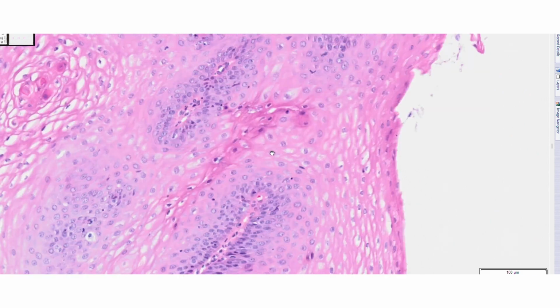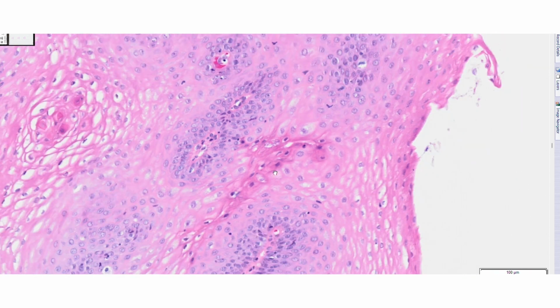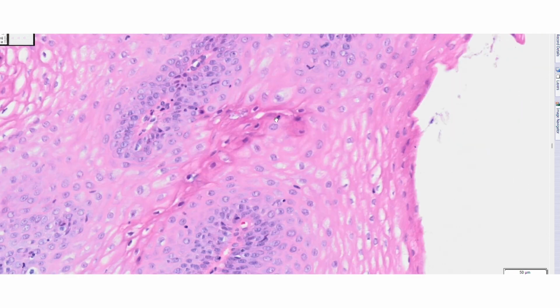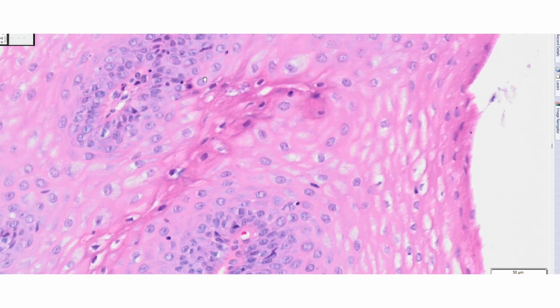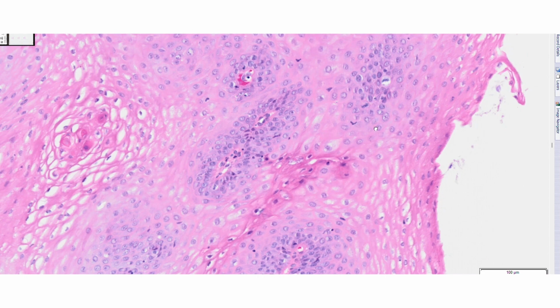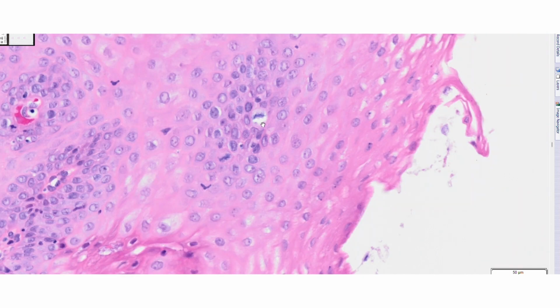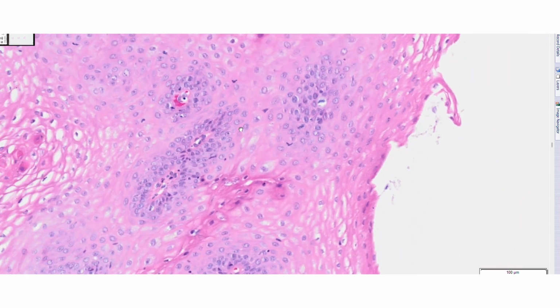But I also wanted to point out here that this is a hypereosinophilic tissue response, which means the tissue is more dense. It's probably dense and harder compared to this tissue here. And there is not a lot of inflammation. I don't see any acute inflammation at all. I don't see any eosinophils. I only see maybe a few scattered lymphocytes here and there. There looks like a couple of mitoses there, maybe.